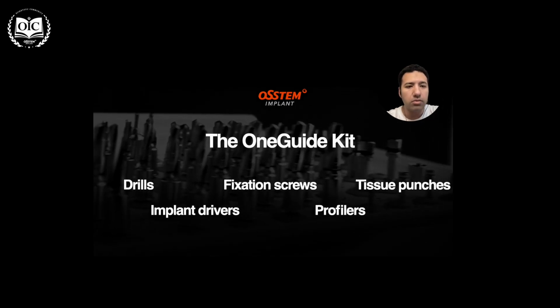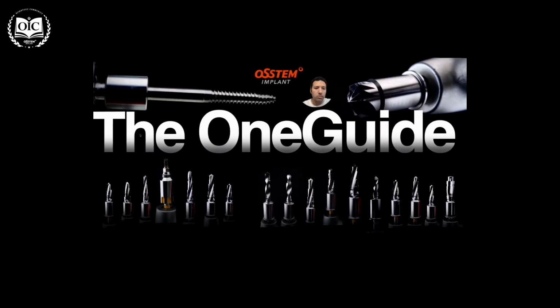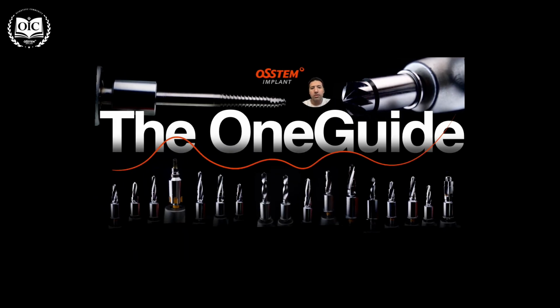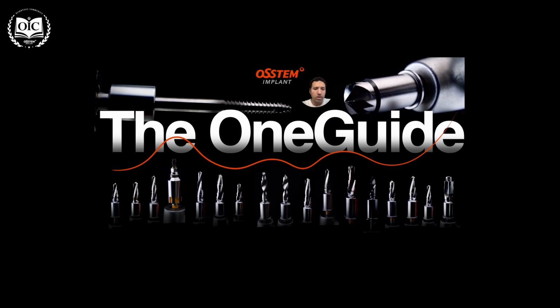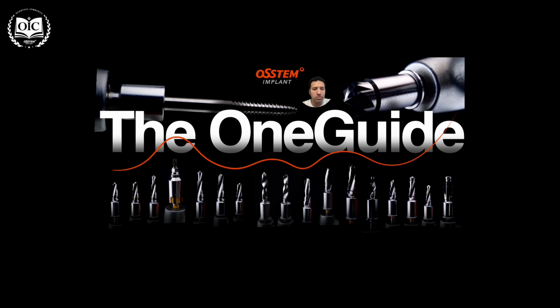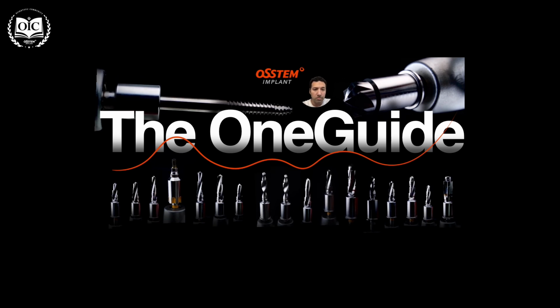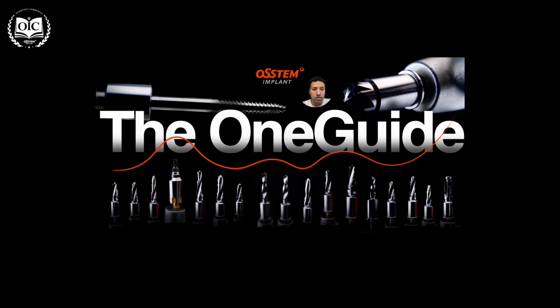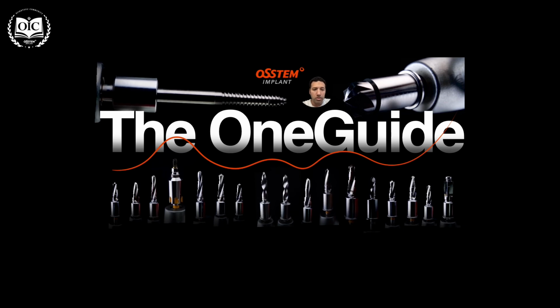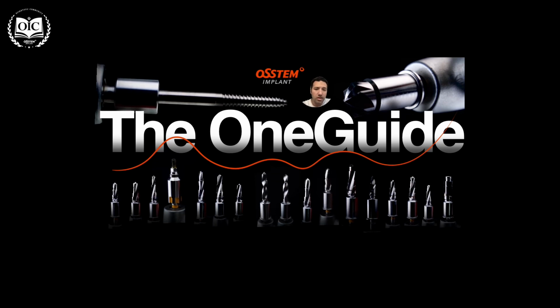Everything you need, you're going to find in the OneGuide Kit, enhancing the predictability and smoothing the process of implant drilling and implant placement, especially in the aesthetic zone when you don't have much margin of error. Actually, all the guided kits on the market have nearly the same components, from the guided drills to the guided implant placement through the drivers. Yet, what you find different between each and every kit, most probably in the good high-end products, is the quality of the manufacturer and the design of the drill in comparison to the design of the implant.